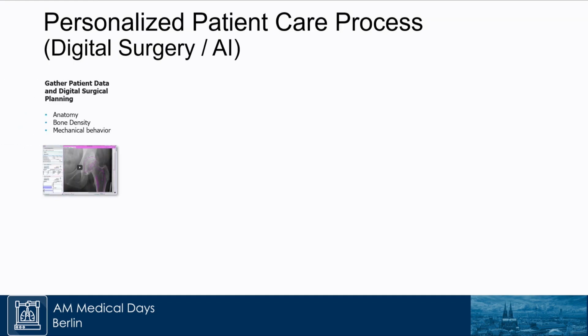As far as where we are going or anticipate to go in the future, it is a point-of-care solution. Right now there is a corporate entity, there is a supplier, and there is a healthcare facility, at least 3 different locations. Sometimes you have 4 or 5, depending on whether the post-processing is done elsewhere. So can we bring some of these processes in-house at a hospital or a healthcare facility?